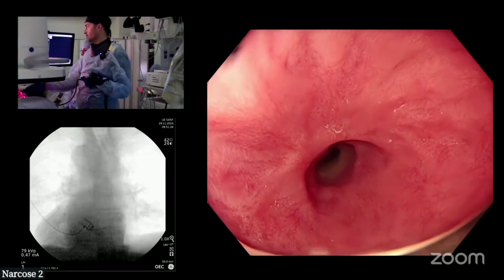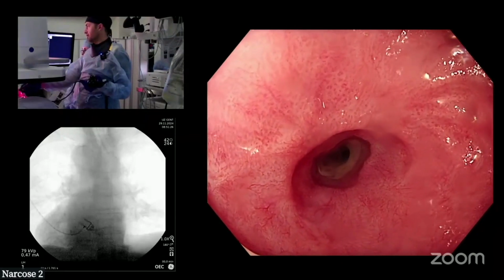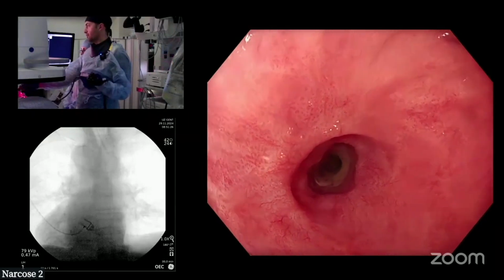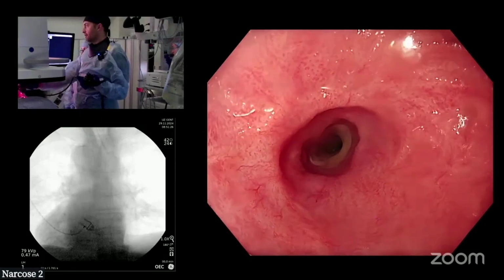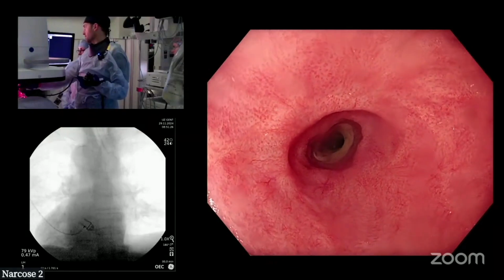And then you should gently apply pressure. And it should not be hard. You should just keep on applying standard pressure, keep the pressure on. I'm pushing my right hand forward a little bit, right? And I kind of want it to fail because I want to show incisional therapy. So I'm just gonna keep this pressure on, right?